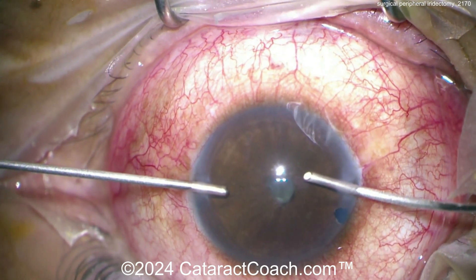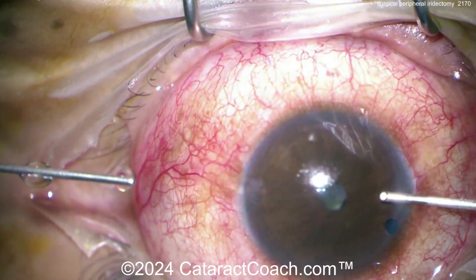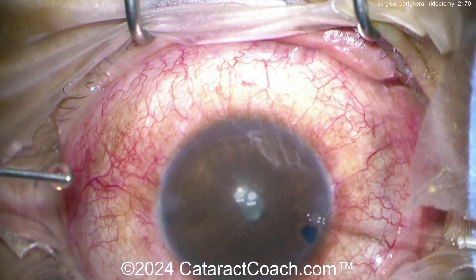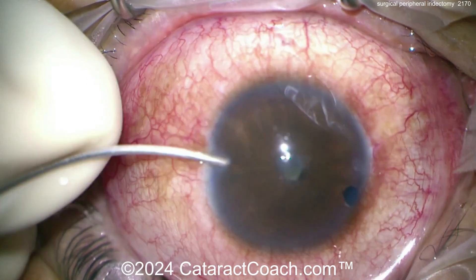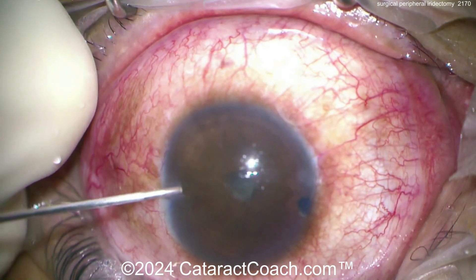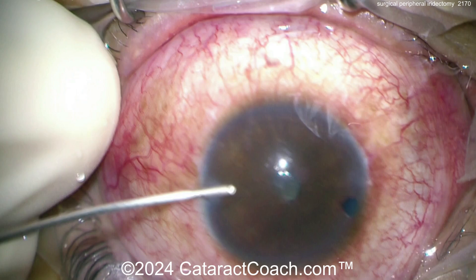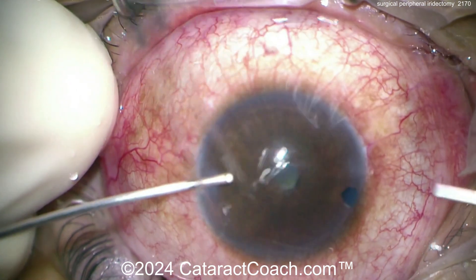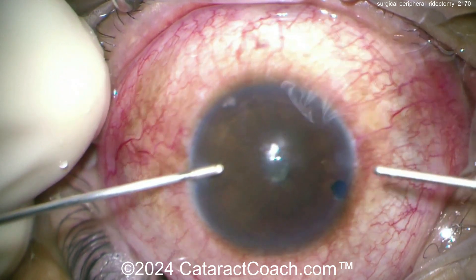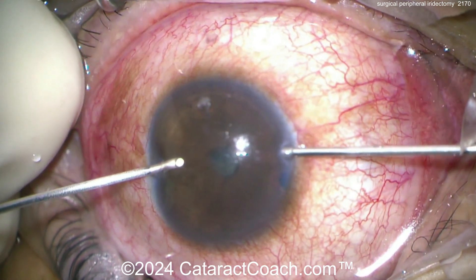Now you can switch hands and do it the other way. In this case the surgeon is going across the eye because the anterior chamber is deep enough. You could also just do it in the sub-incisional space — as soon as you put the vitrector in the eye, go bevel down and try to go towards the periphery to make the peripheral iridectomy. Use low vacuum — maybe 200 mmHg — and a very low cut rate of 100 cuts per minute or less.